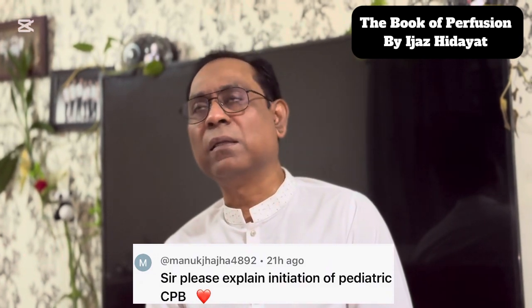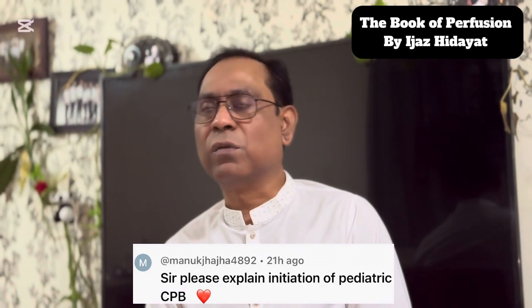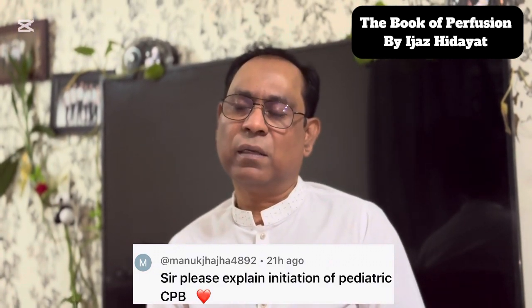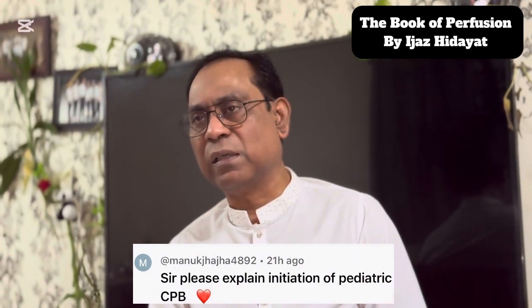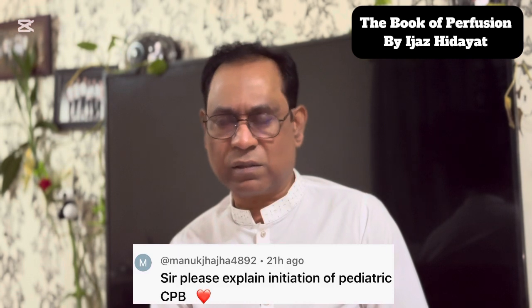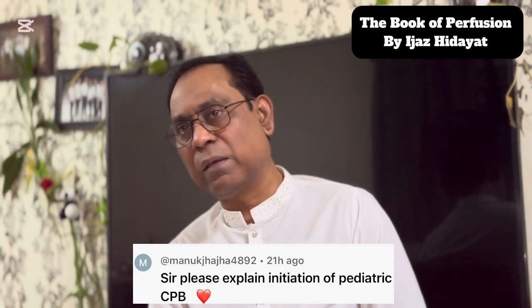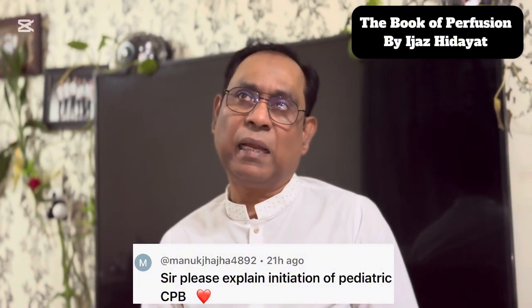But usually in adult surgery, we have a huge intravascular volume, like 3 to 5 liters, and mixing in your priming volume of around a liter will not make such a difference in blood factor concentration, even the blood clotting factor concentrations.